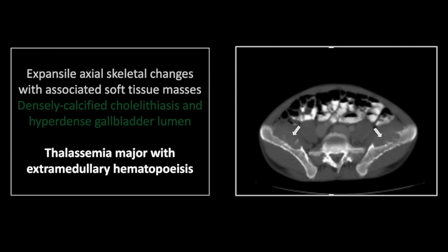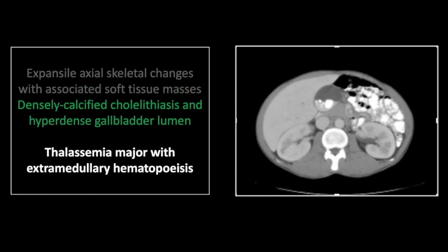Note the spacing of the trabeculi throughout the iliac bones. In the right upper quadrant, there are classic bilirubin gallstones, varied in size, densely calcified, and associated with layering milk of calcium within the gallbladder.